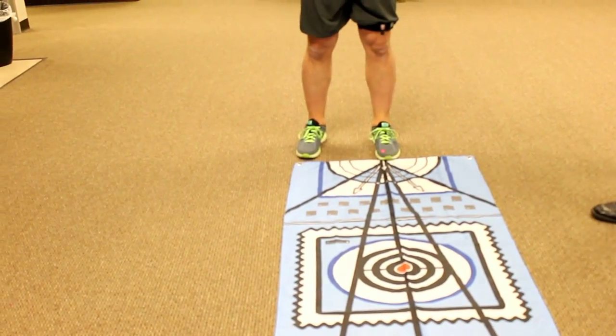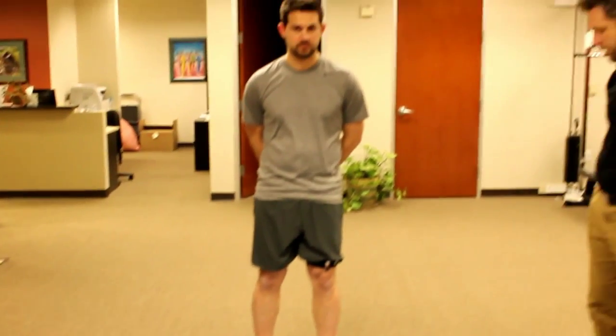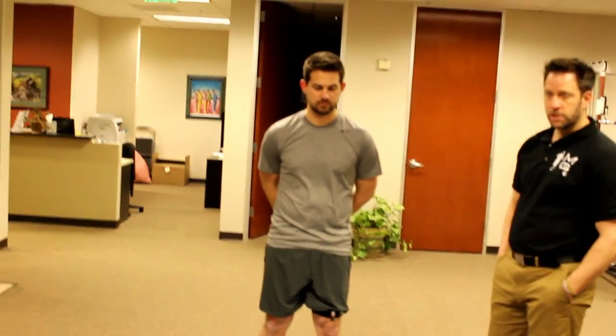Looking for consistent patterns of movement or proprioceptive balance faulty patterns of movement. So once we've established what faulty pattern Chris has that might be contributing to his symptoms, we can work on correcting that.